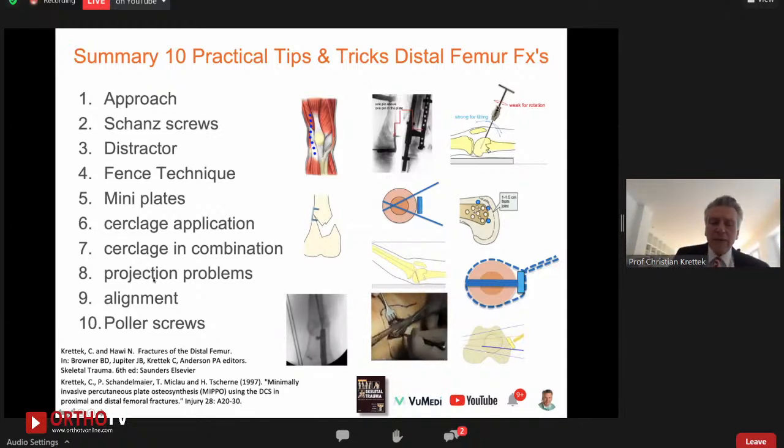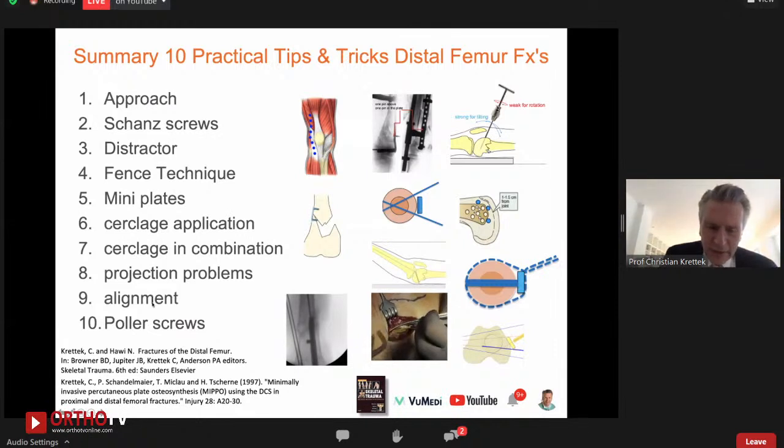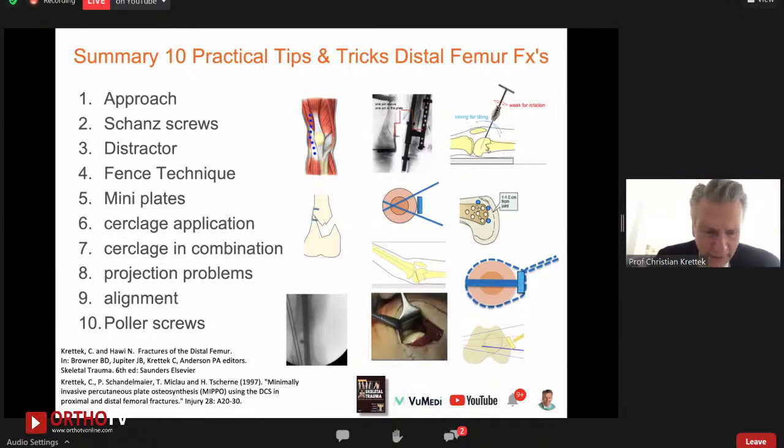very strong. We have projection problems. We need to know about this. Alignment tools, the cable technique, and the lesser trochanter shape sign. And finally, Poller screws for retrograde nailing can be very advantageous in several instances.